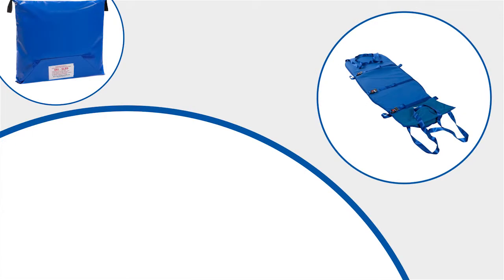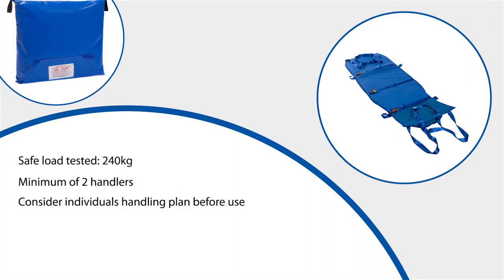The ski sled has been safety tested to a maximum weight of 240kg, although the maximum load to be pulled downstairs should be recommended by your manual handling advisers. It is advised that a minimum of two people handle the ski sled, and as a general rule the maximum weight being pulled should not be more than the combined weight of the handlers. Each patient should have their own handling plan, and this should be considered before transferring any patient using this equipment.